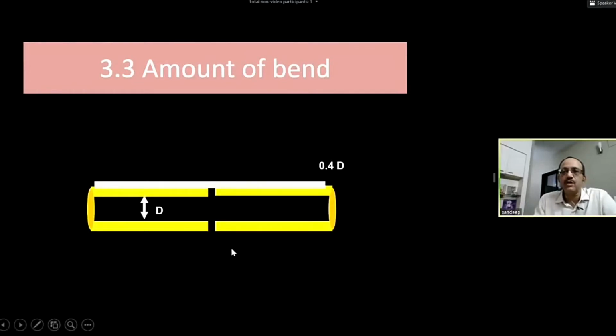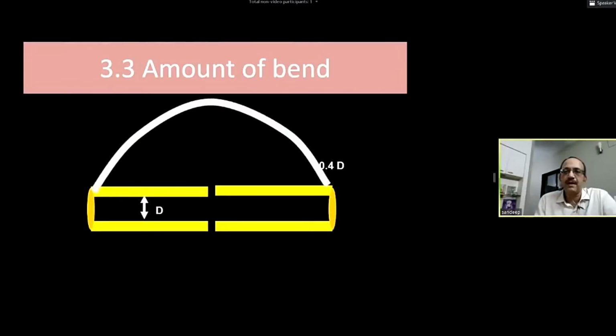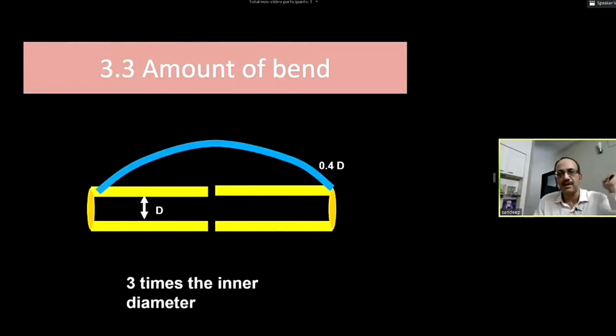The next question is, how much do you bend? So again, the inner diameter comes to our rescue. If the inner diameter is about 8 millimeters, then you will multiply it by 3, and that is your bend of the nail, the apex of the bend. So your choice of the nail is 40%, and the apex of the bend is going to be 3 times the inner diameter. So you choose the nail 0.4 into D and bend the nail 3 into D. So for an 8 millimeter canal, the apex of the bend will be 24 millimeters.